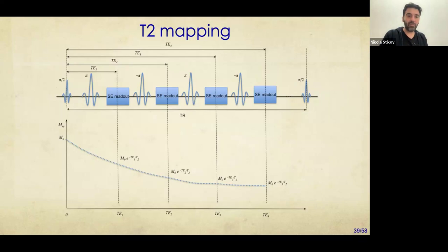But then your signal to noise ratio is going to be very short, because you don't have a spin echo. You just have something called a free induction decay. Back in the day, that was good enough, especially when people were not doing imaging, but just characterizing chemical compounds, because you could repeat it over and over and you can average. But when you try to make an image of the brain, then you're limited by how long the person can stay in, and that's where this spin echo comes into play. Now, if you cannot refocus well, there will be artifacts in the image.